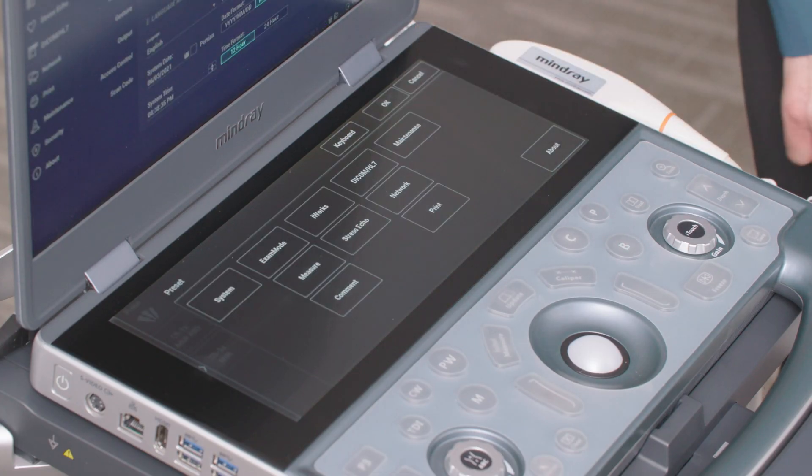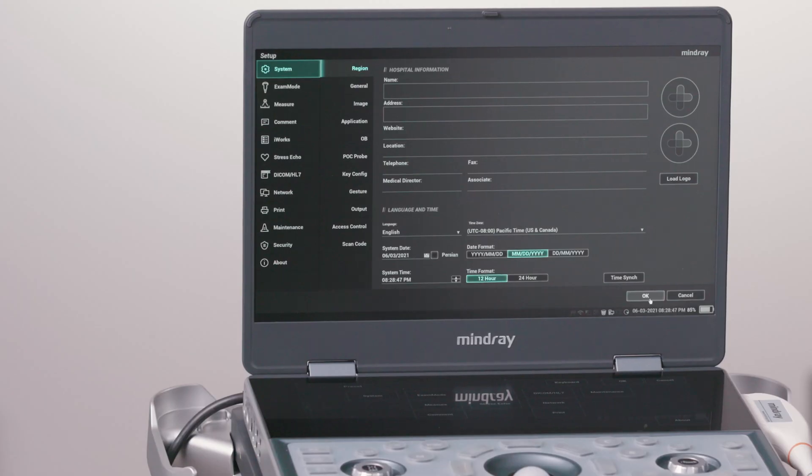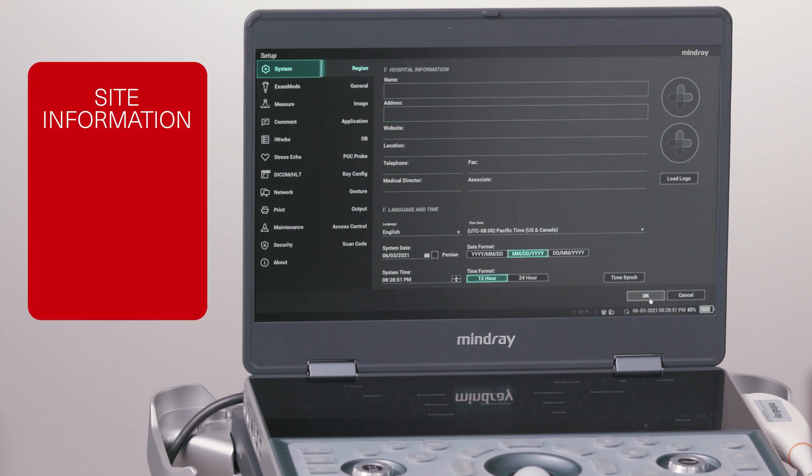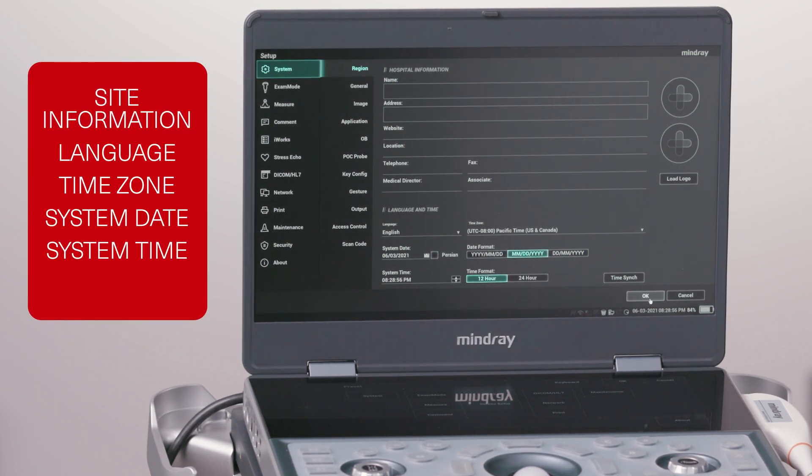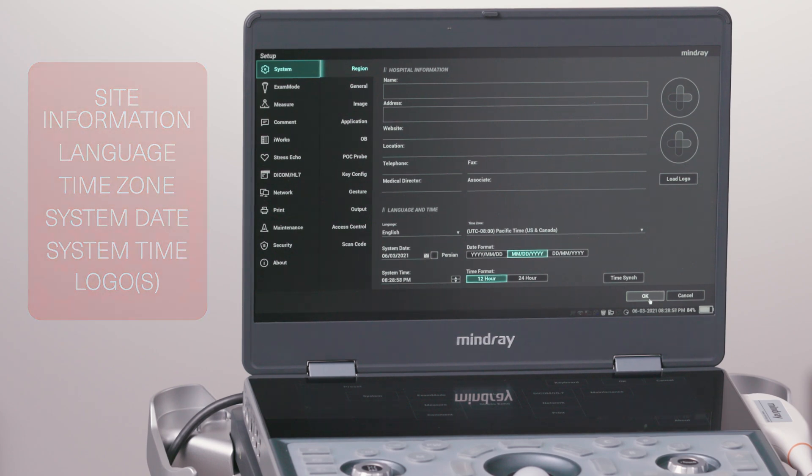Tap the Setup button. This will take you to the system region page. Here you can enter the customer's site information, language, time zone, system date, system time, and up to two logos. The setup function is designed to set the configuration parameters of the operating system and the main user workflow setup data. This is where customization and preset adjustments are accessed, as well as networking, printers, and software version information.